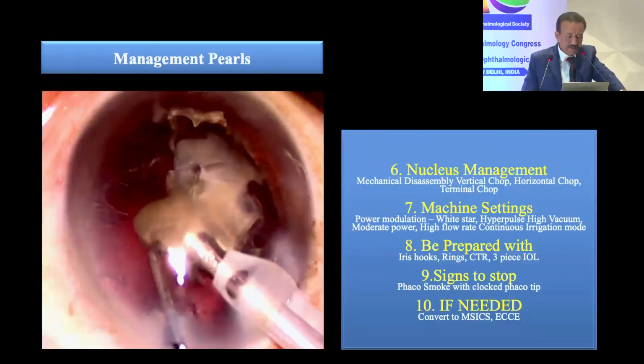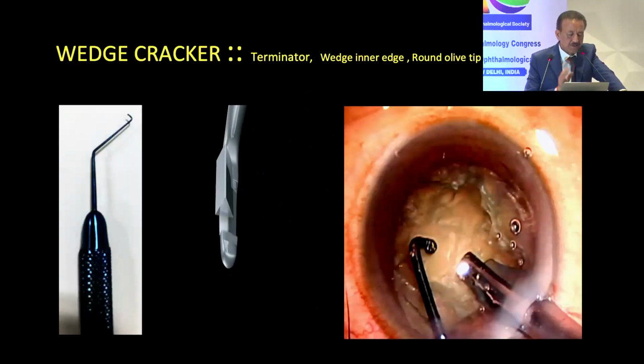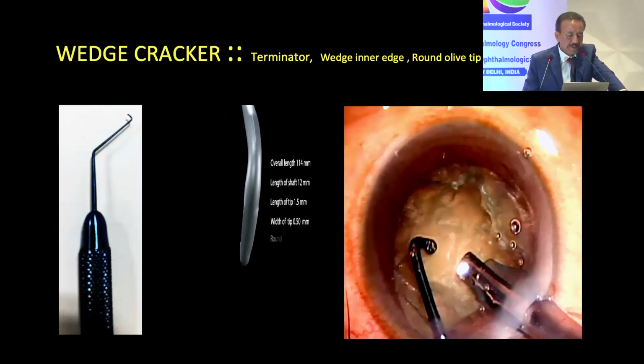What I said is that the most important thing is the cracker. The cracker is very important. What I'm going to show here is the terminator; we call it the terminator. As you can see, the shape of the terminator is a little different from the other choppers. It has a blunt tip.